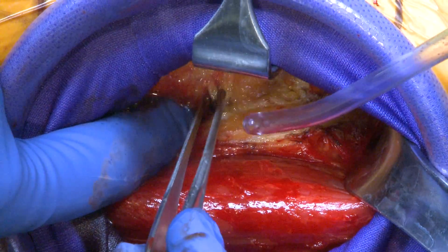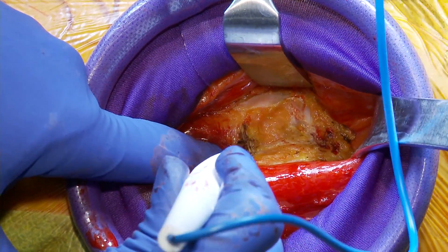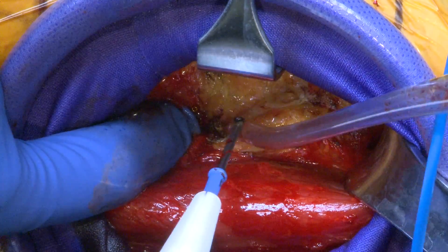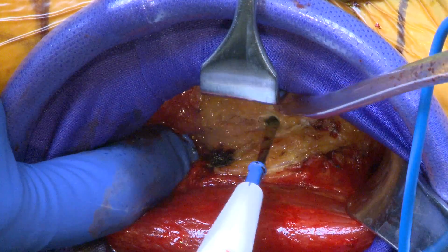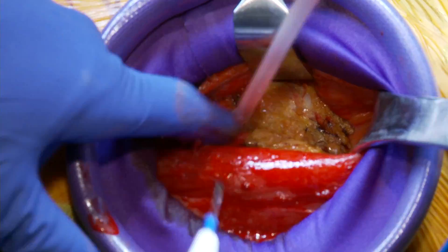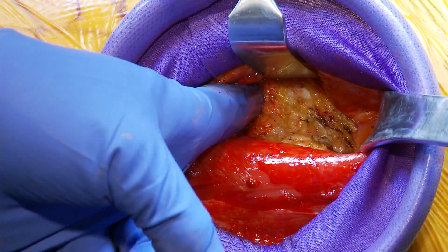Otherwise they will continue to bleed through the case. These lateral femoral circumflex vessels should be kind of at the midpoint of the incision, and that tells me I'm going in the right proximal-medial direction. Once I've gone through those vessels I can safely dissect a little bit deeper.